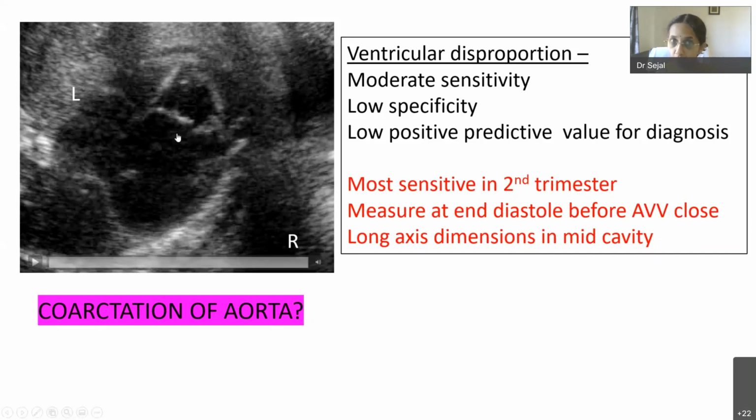So I run through, as all of you thought about tricuspid valve disease. Any tricuspid valve disease, presence of tricuspid regurgitation can cause that. Second is, if I have my foramen ovale or ductus arteriosus prematurely closing, especially in third trimester, also my right heart dilatation could be unexplained. But if those things are ruled out, then I will think about a lesion in the left heart. So I run through my left heart structures and check the Z-scores. If the Z-scores are acceptable, LV is reaching apex, practically, I would think this may not be HLHS, but then it can be a hidden coarct.